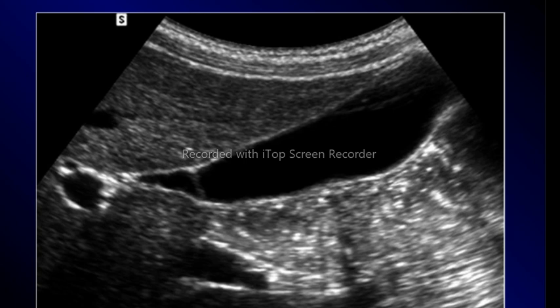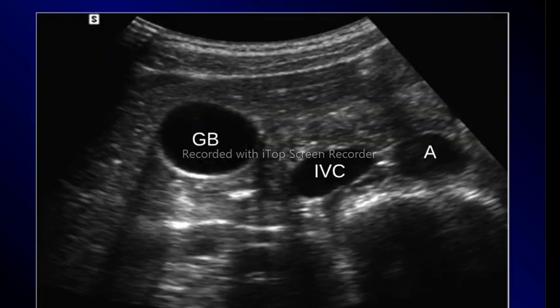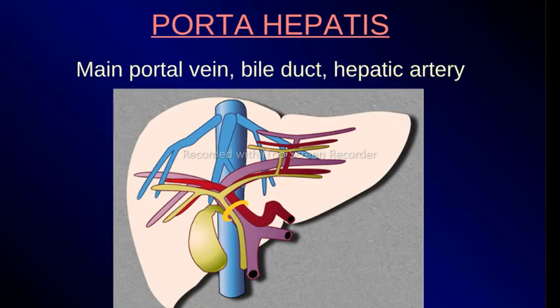So this is an example here. If your gallbladder sits in long axis, this is the fundus, this is the body, and this is the neck. Somewhere beyond this point is where you have the cystic duct that drains bile away from the gallbladder. Then this is the transverse image showing us the gallbladder in cross-section, appearing as a fine cyst. This is your IVC, which appears ovoid, and the aorta, which usually appears as a circle. This is your aorta there, and your spine.